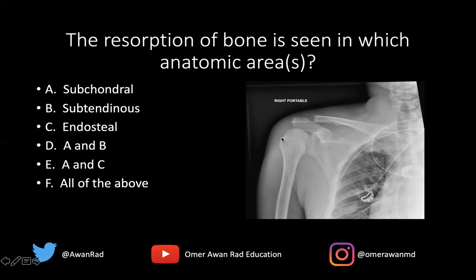If we take a look along the greater tuberosity, there's also a little bit of resorption there. This is where tendons attach — the rotator cuff tendons: supraspinatus, infraspinatus, teres minor. So we have an example of subtendinous resorption here. We don't have any endosteal resorption. So the best answer here would be A and B — subchondral and subtendinous resorption. We can see that where the arrows are, there's osseous resorption of bone.